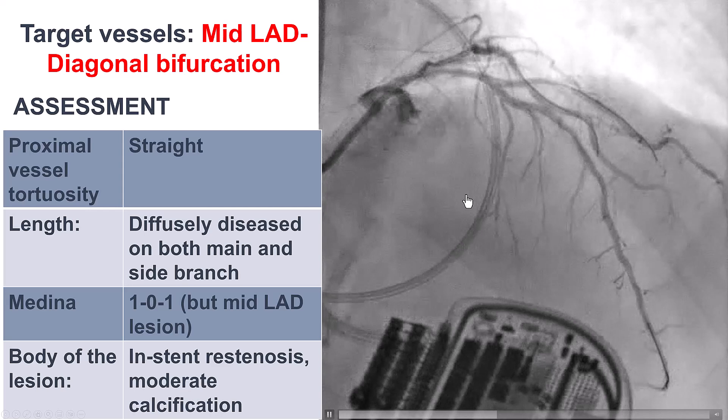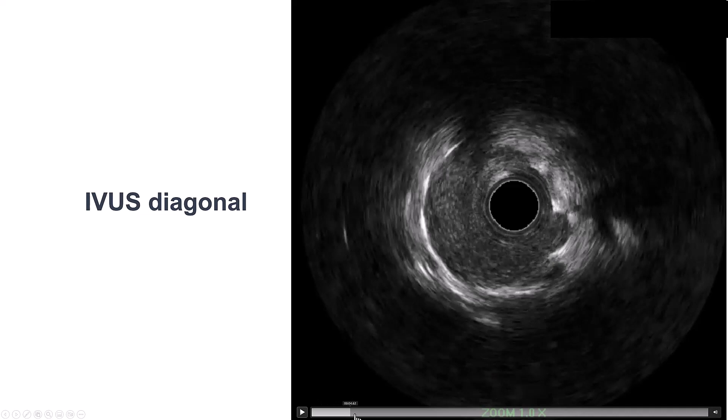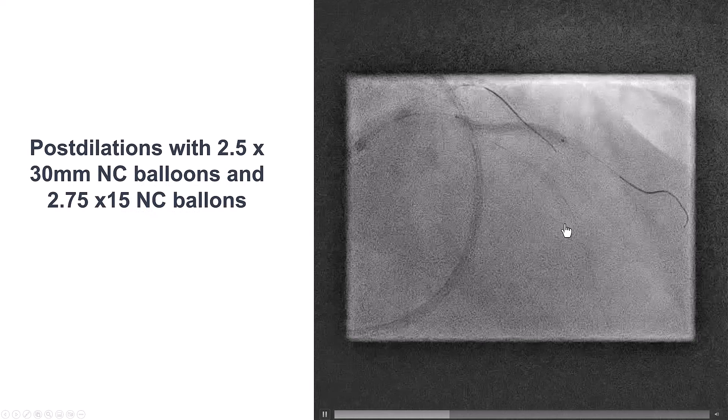We wired both vessels. We did predilatation of the diagonal branch. Intravascular ultrasound again is very important to make sure we have expansion of the stents. That demonstrates that for the most part the stents are expanded. So we placed a 2.75 by 20 millimeter drug-eluting stent. It was post-dilated and that provided a nice result.